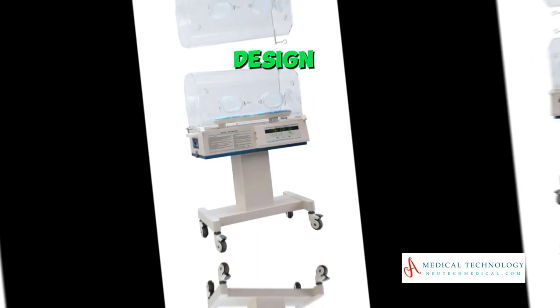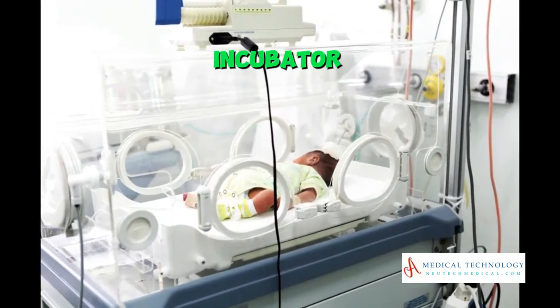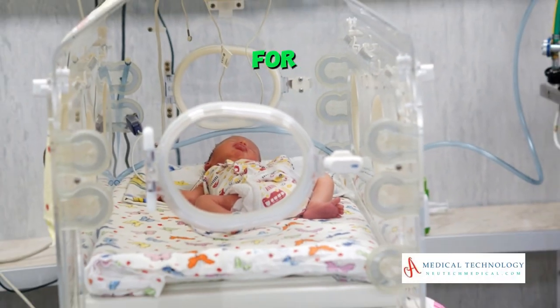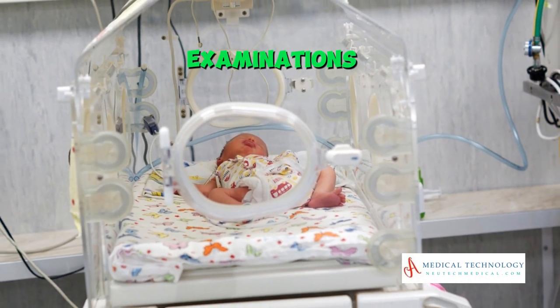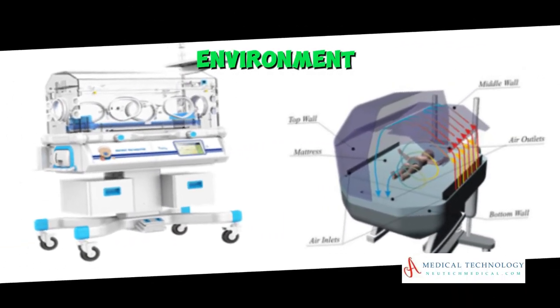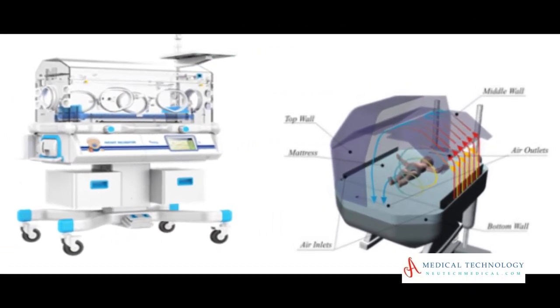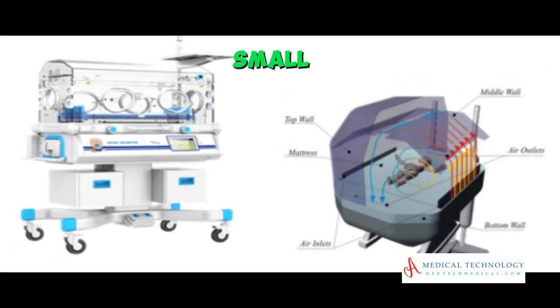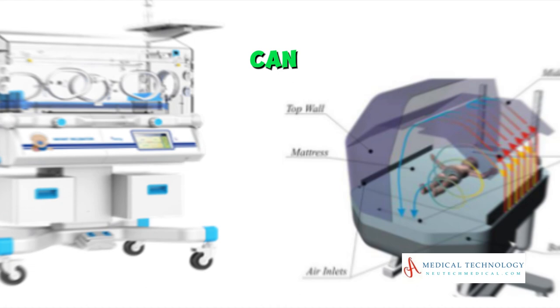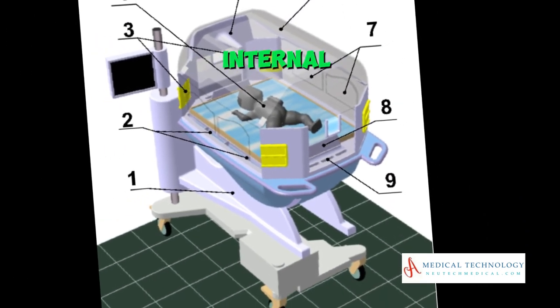Access and design — accessibility. The design of the incubator allows healthcare professionals easy access to the infant for medical examinations, treatments, and procedures without disturbing the controlled environment. The incubator typically has small ports or doors through which medical interventions can be performed without compromising the internal conditions.